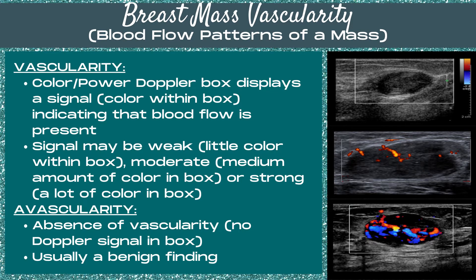Vascularity is when the color or power Doppler box displays a signal, so there's color within the box indicating that blood flow is present. The signal may be weak, with little color in the box; moderate, with a medium amount of color; or strong, with a lot of color signal in the Doppler box. The first type of breast mass vascularity is avascularity — the absence of vascularity in a mass, where there's no Doppler signal within the box.